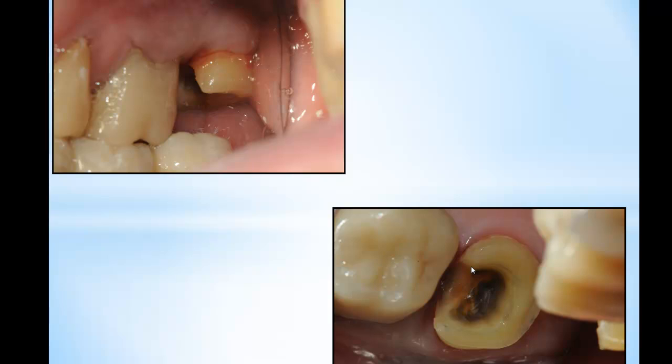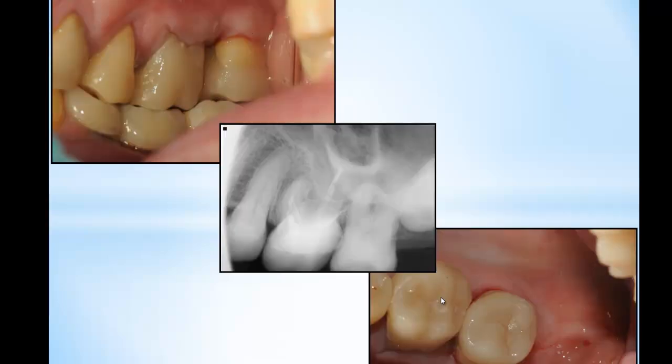But again, it's not cosmetic work that I have to worry about, and the patient is not asking for anything else. So I prepped the tooth as much as I could to keep the enamel ring available, removed the decay, and this is the final stage.